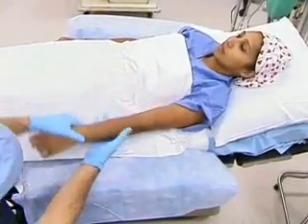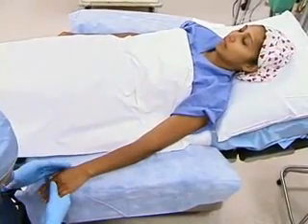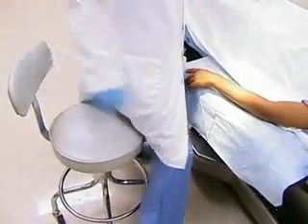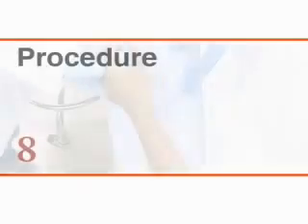When the selected site is in an upper extremity, the patient should be placed in the supine position with the arm supported. A comfortable position for the practitioner and proper lighting are important for successful intravenous cannulation.